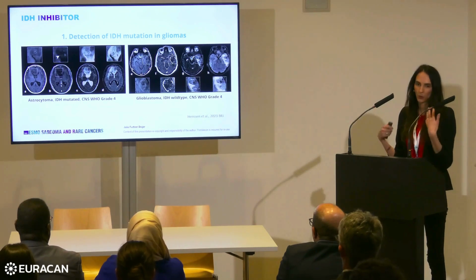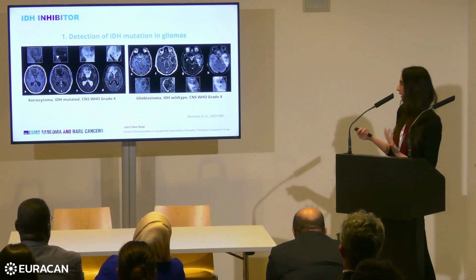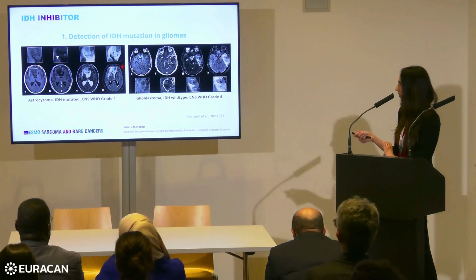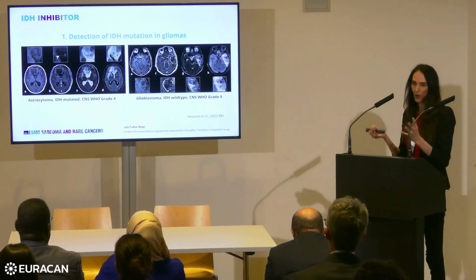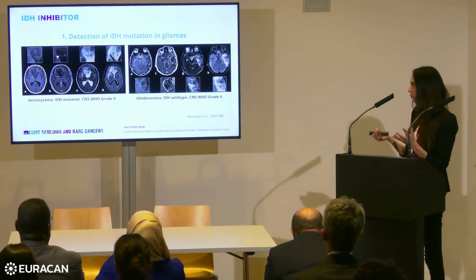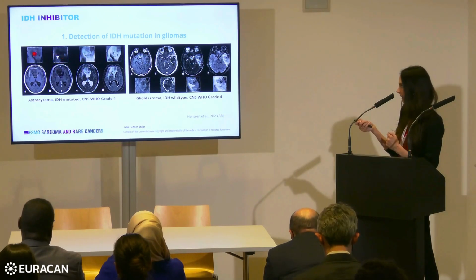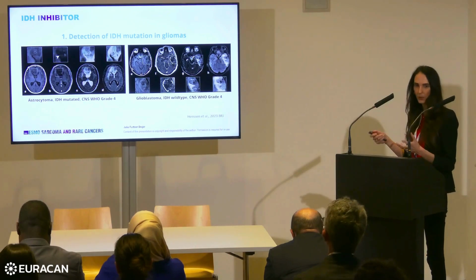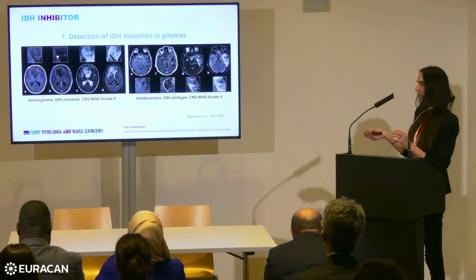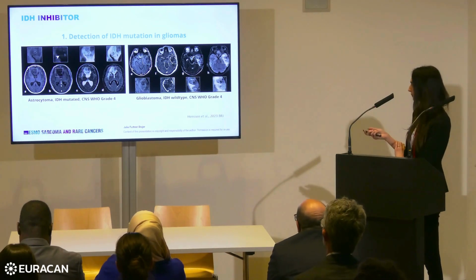When we come to higher grade, usually an astrocytoma, IDH mutant, grade 4 presents with a large part of non-contrast-enhancing tumor and only shows some very tiny spots of contrast enhancement. In comparison, glioblastoma, IDH wild type, usually shows a vivid contrast enhancement in the periphery and central necrosis.